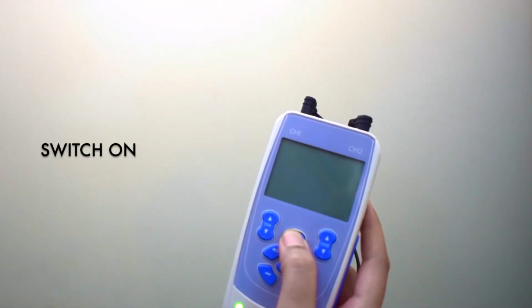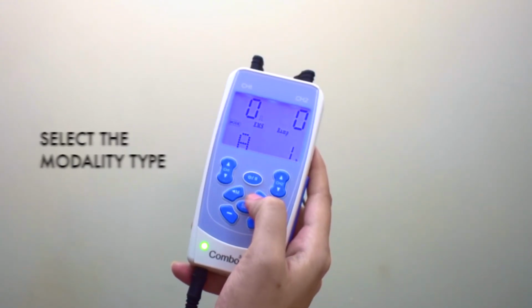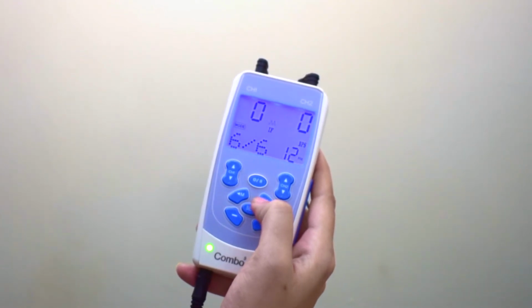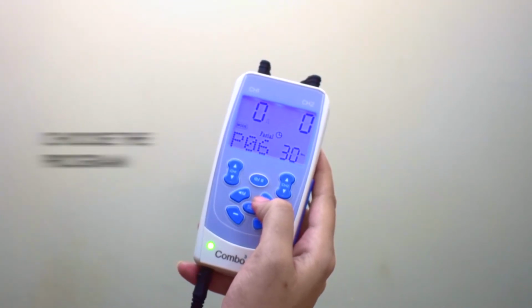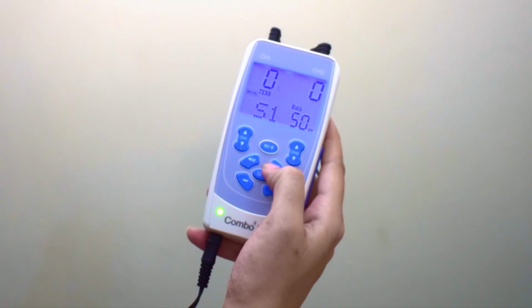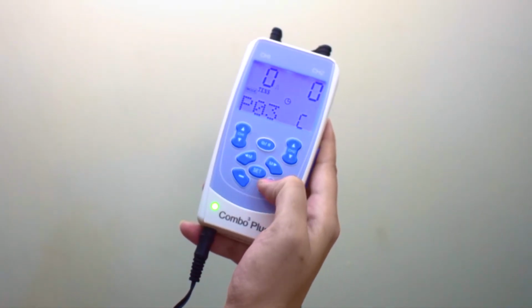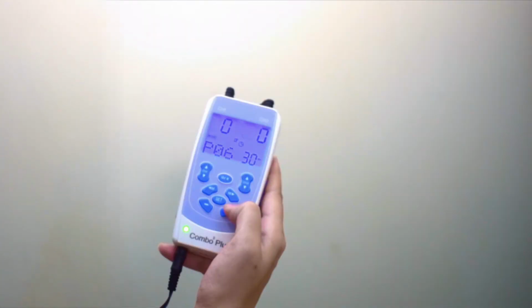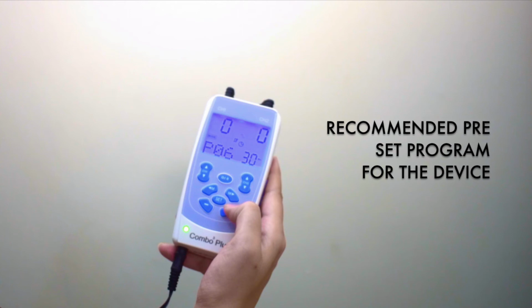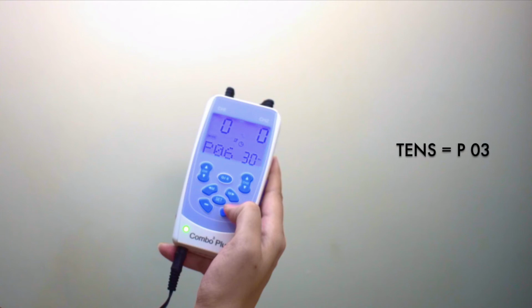To use this device, switch on the machine and select the modality type between IFT, EMS or TENS. You can do this by pressing the mode buttons. After pressing the mode buttons, you can then choose the preset program with the help of the plus or minus button, and you can use either the recommended program or the program that you have chosen for yourself. Here are some of the preset recommended programs that we usually recommend for our users. P03 or program 03 for TENS, program 09 for EMS and program 05 for IFT.